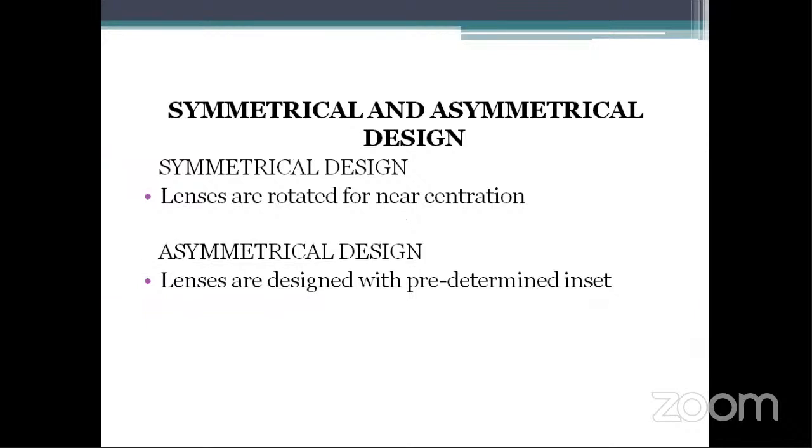Next, symmetrical and asymmetrical design. Symmetrical design lenses are rotated for near centration, whereas in asymmetrical design, lenses are designed with predetermined inset.